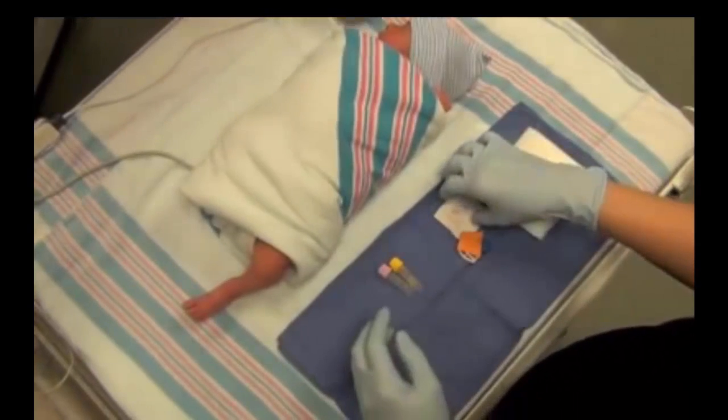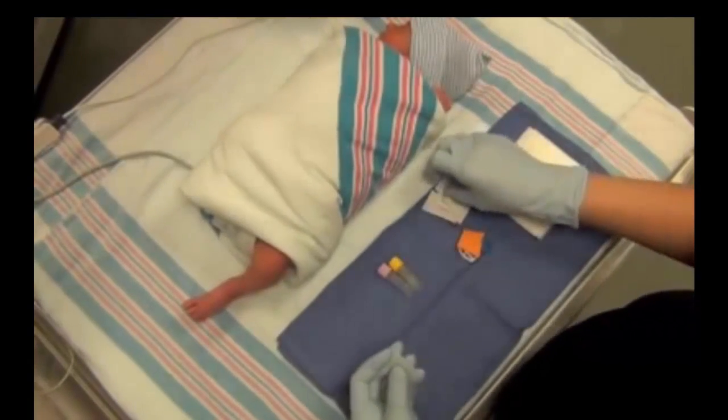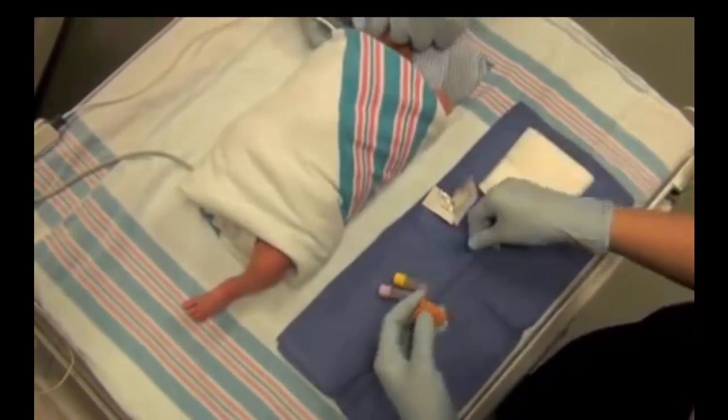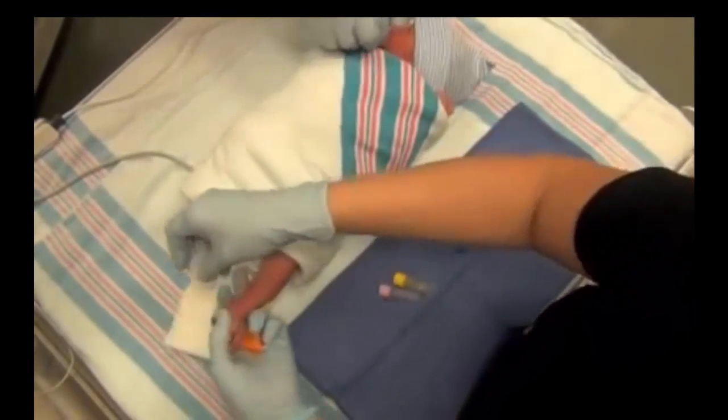The preferred area for capillary sampling is the outer aspect of the heel. Do not use the end of the heel. The calcaneum is superficial at this site, and there is an increased risk for the development of osteomyelitis.